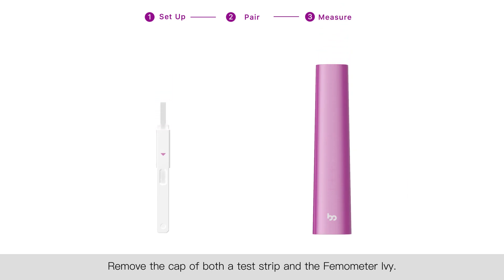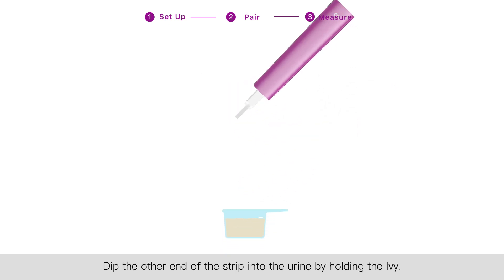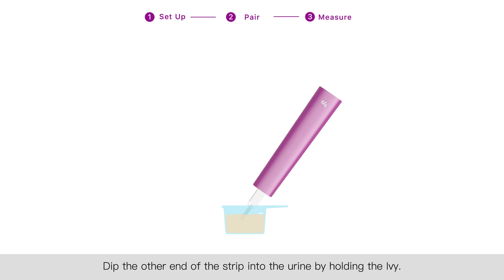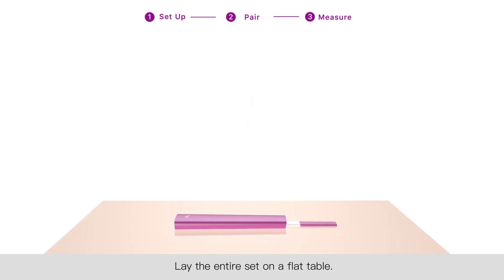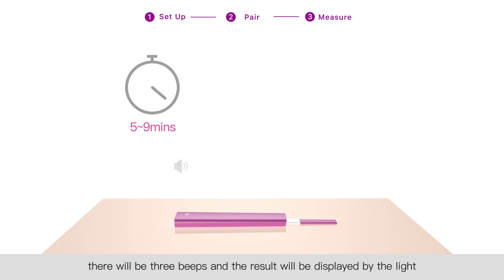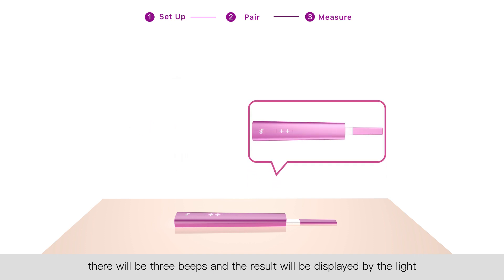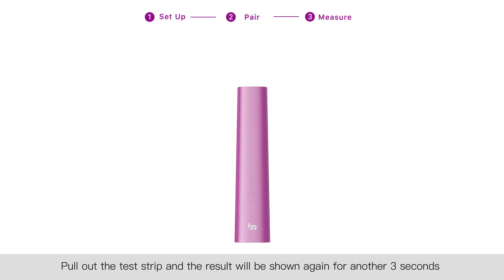Step three: start measuring. Fill the cup with the urine sample. Remove the cap of both a test strip and the Femometer Ivy. Insert the strip into the Ivy as indicated. Dip the other end of the strip into the urine by holding the Ivy. When you hear a beep or the indicator lights start flashing, quickly pull the strip out and put the cap of the strip back on. Lay the entire set on a flat table. After five to nine minutes, there will be three beeps and the result will be displayed by the light for thirty seconds.